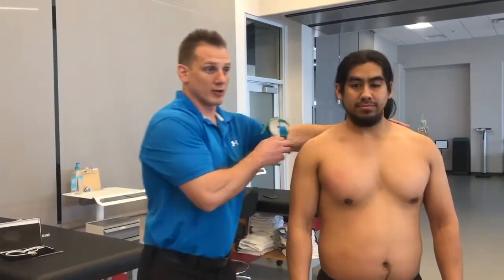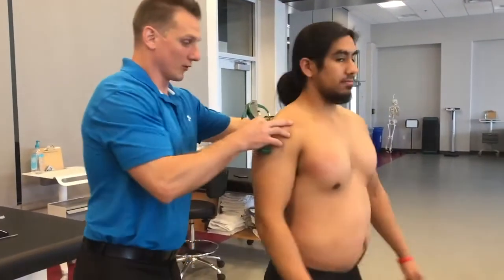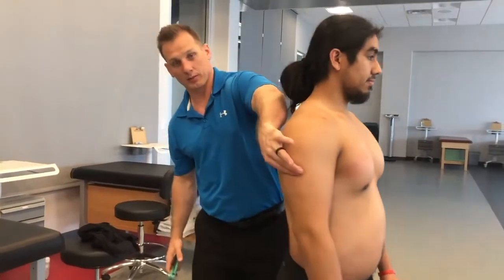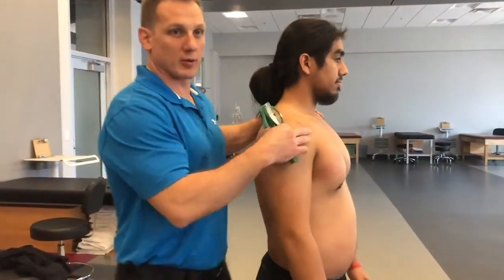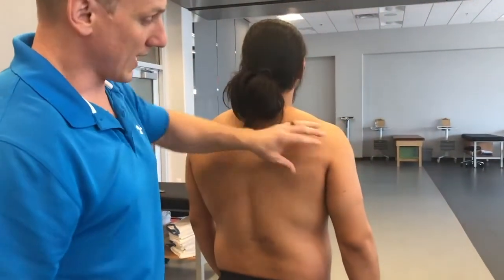When doing your sites, if there's a posterior site, you need to either physically move your client so that you can get to the pinch, or if your client doesn't really want to move, you need to move to get to the pinch yourself. For this demonstration, I'm going to move my client so that you have a good visual.